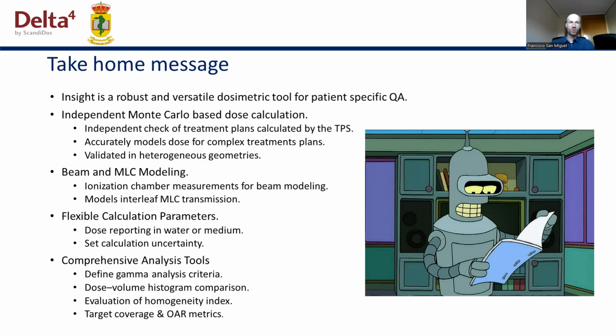It is a Monte Carlo-based dose calculation, providing a secondary independent check of treatment plans calculated by the TPS. This point was particularly important for us since our treatment planning system calculates dose to medium using a Monte Carlo algorithm.